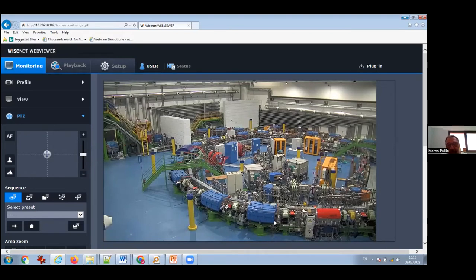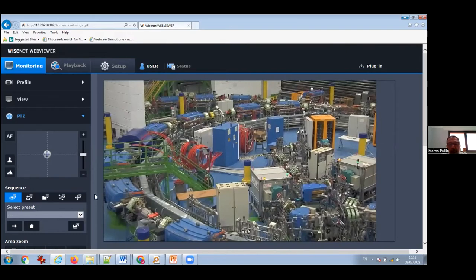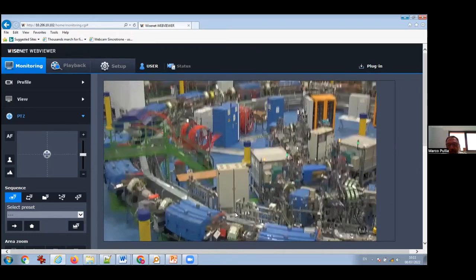I don't know if you have already had a lecture or heard how the CNAO accelerator is made, but we have in blue our dipoles. We have 16 dipoles. We have in light green our quadrupoles.